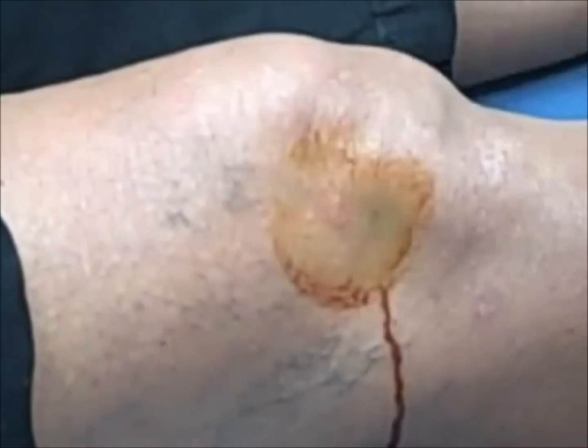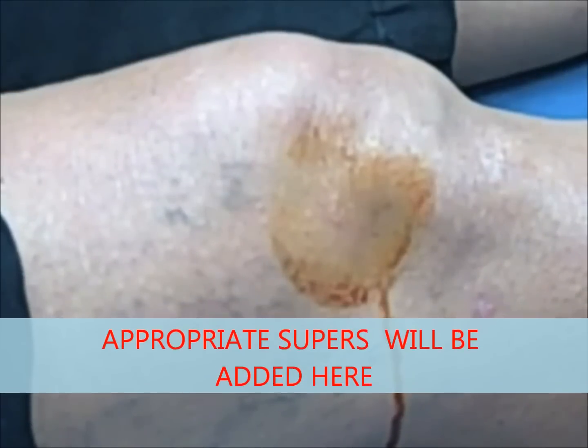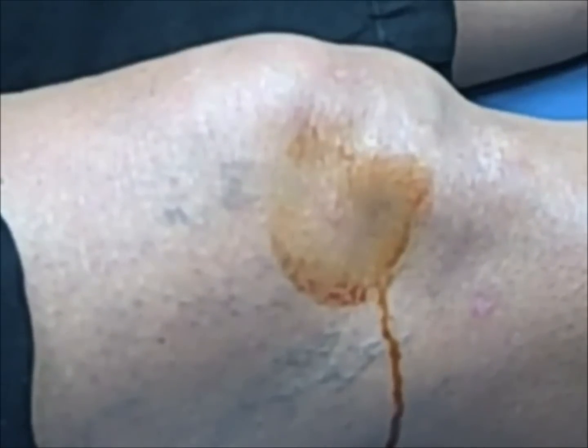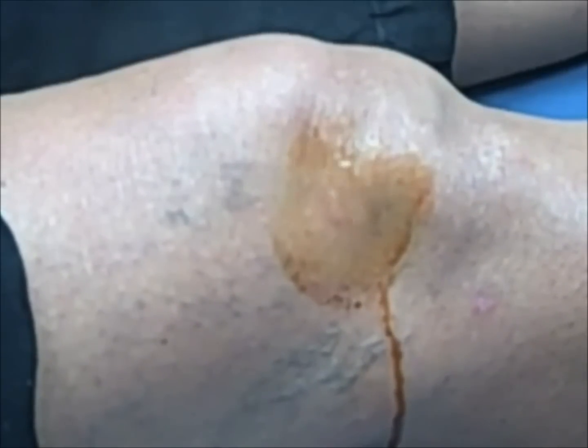We're also going to be using a 22 gauge 1.5 inch needle for the injection. For skin anesthetic, we're going to be using an ethyl chloride spray, and we'll spray the skin for approximately 5 seconds, about 6 inches away from the skin. This will help with pain relief from initial needle insertion.